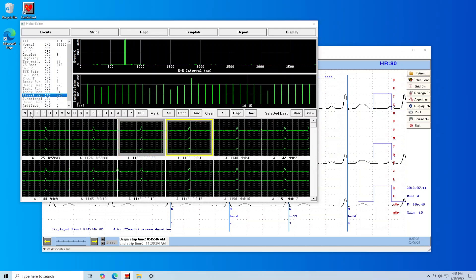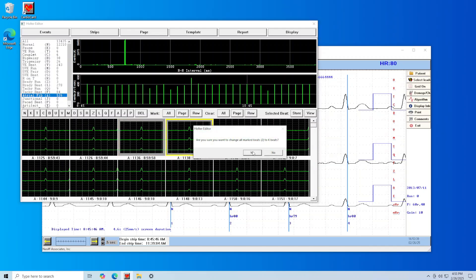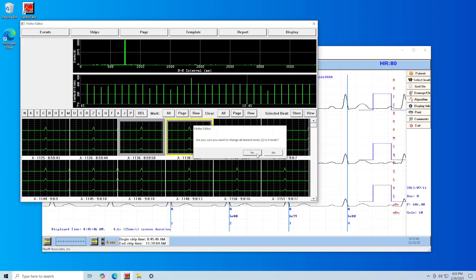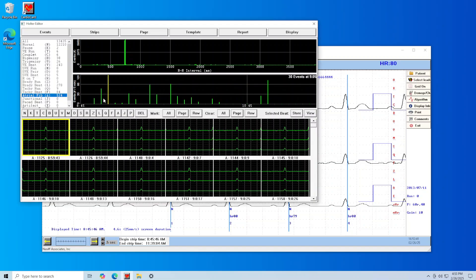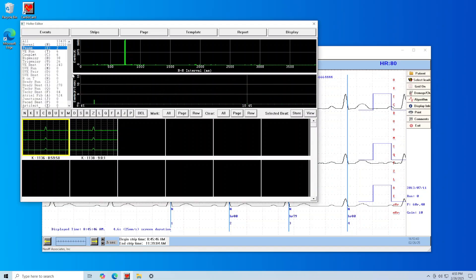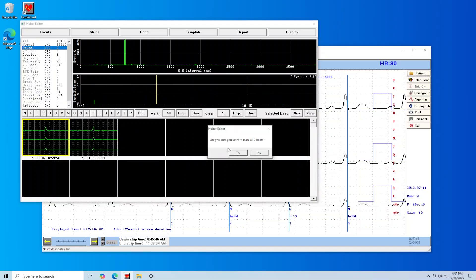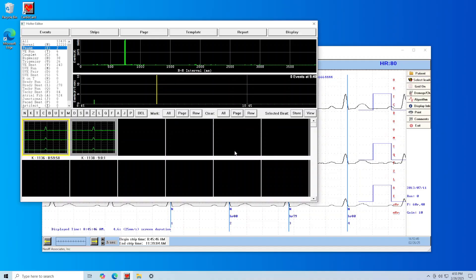Every time you make a beat type change, it will ask you to confirm this change. Make sure to choose yes or no correctly.